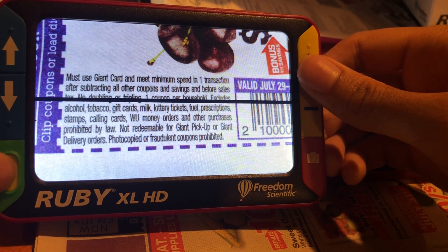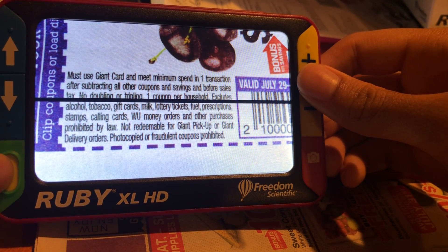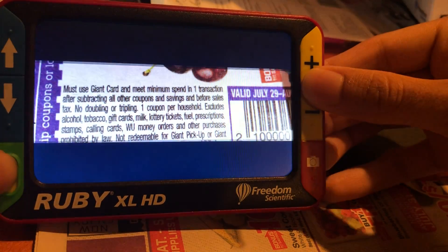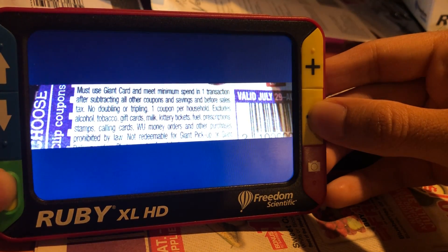If I want a reading mask, I simply press the power button again and then the plus or minus, and it switches to the mask. I would adjust the size the same way.